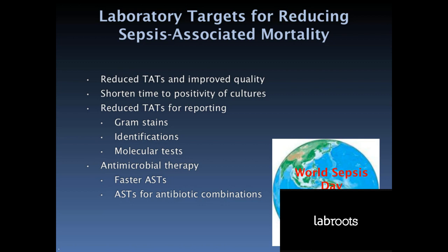Our hospital has a surge of COVID patients. Blood cultures are routine for each patient admitted. Does the virus survive in blood culture bottle broths? That's a really good question for another reason. I don't know, someone else could tell you.